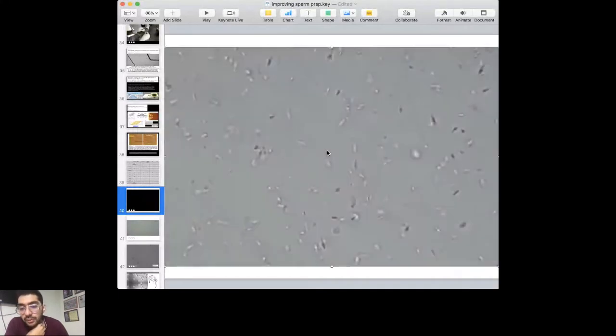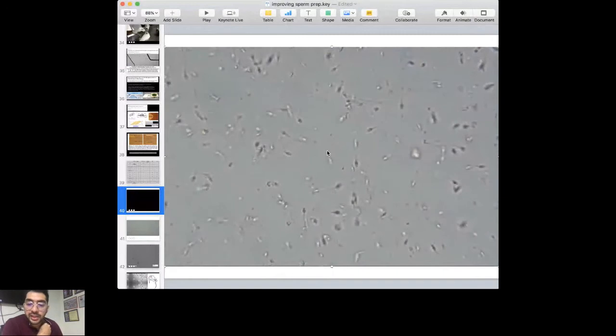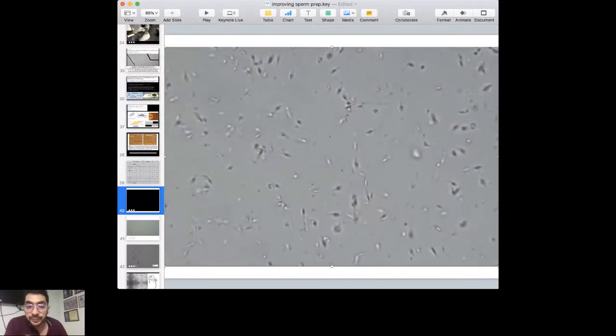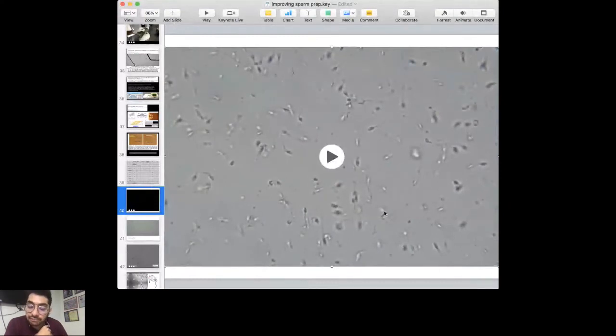So Shweta says density, Ankita says density. I don't know who AFC is, but that person also says density. In such a scenario, when I have such poor motility, I am very cautious of doing density gradient. Only because if I look clearly at the sample, this is a sample of agglutination, right? There are sperms sticking to each other, and this sample is very viscous, so you will not get good sperms after density gradient.